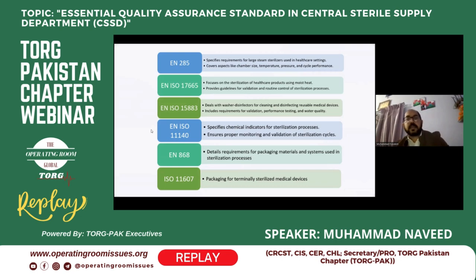And time duration, how we can achieve the A0 value for thermal disinfection, and what indicator we have to use to validate that process. This standard tells us about these things.